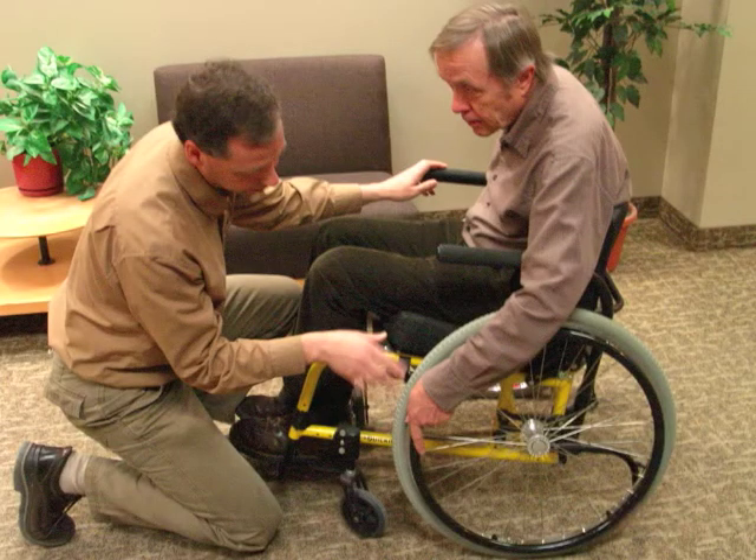You should ensure you are familiar with your wheelchair's footrest mechanism. If you don't know, you can ask a healthcare professional or visit a wheelchair vendor.